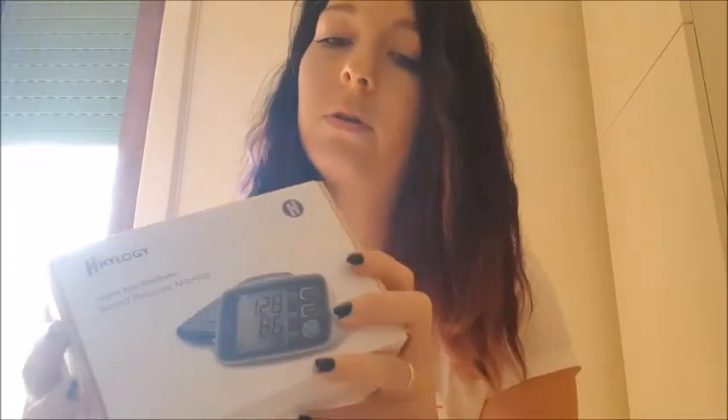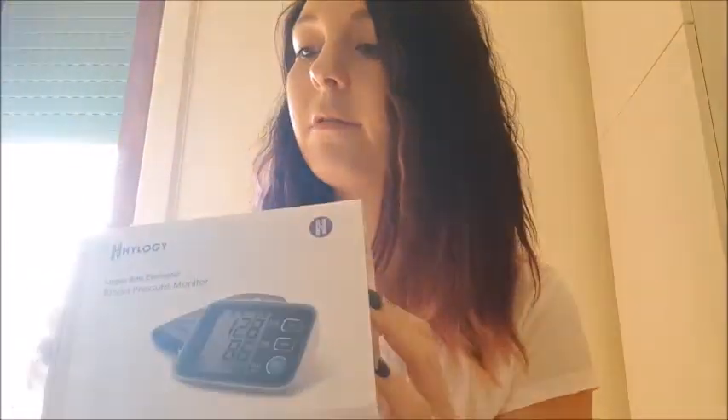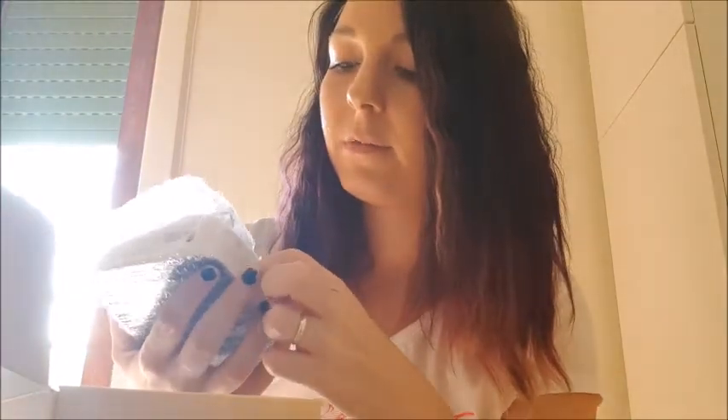It really looks professional — like something expensive. I've had less pretty packaging for more expensive items. Right out of the box it's in bubble wrap, which I love. It's light — though I should have the right batteries here at home, because I don't think it comes with them.